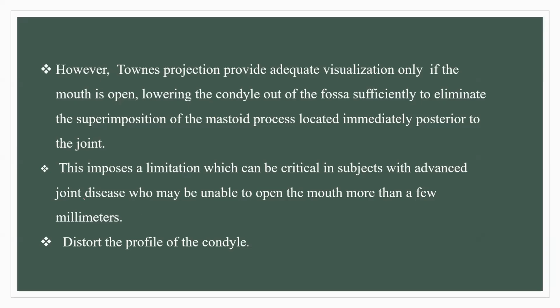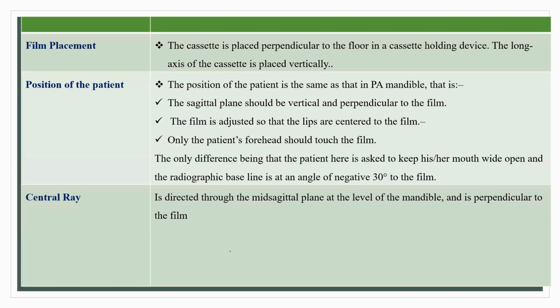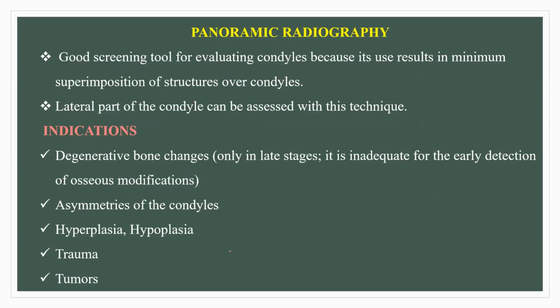They can be, in case of advanced joint diseases where the patient is unable to open the mouth, will not be able to use this technique and also distort the profile of the condyle. Sometimes there can be a distorted condylar profile. Okay, so these are the limitations.